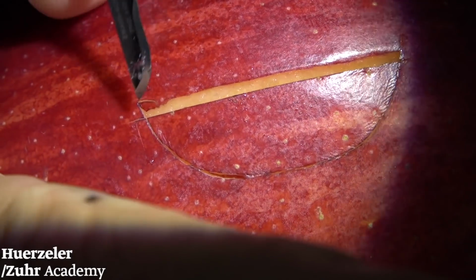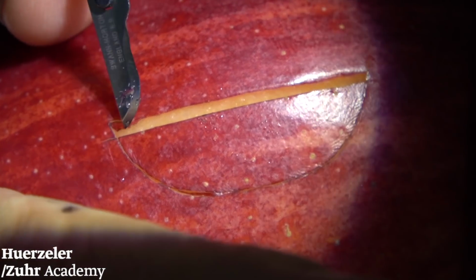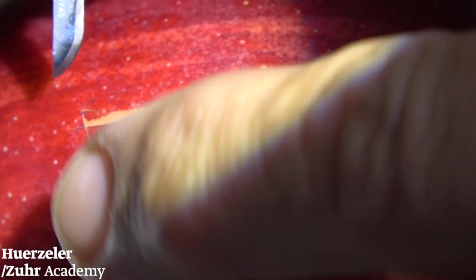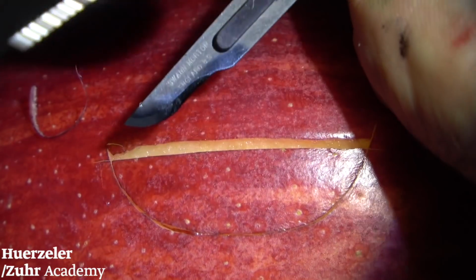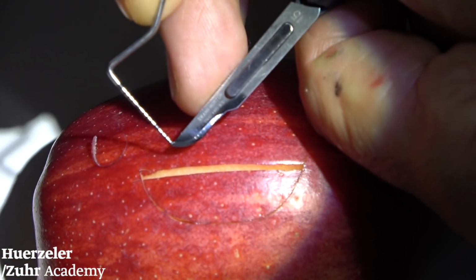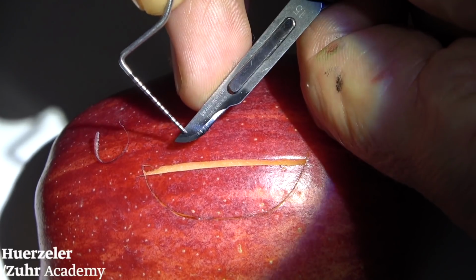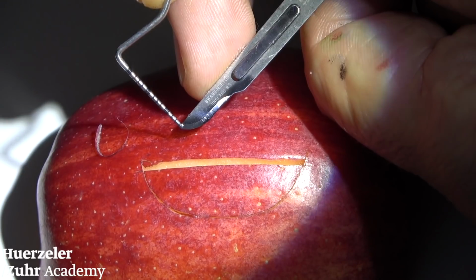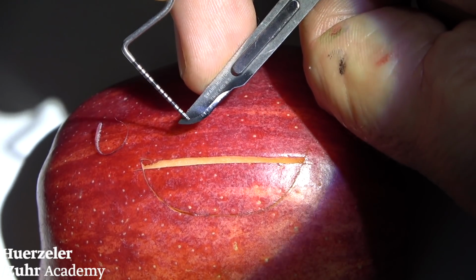And now comes the moment where I need to work in this direction. I have to work with the tip of the blade, and that's why I need a very big surface here. You remember? I said you need a blade which has a big surface here. You don't want a 15C here. This blade does not have a wide, bright surface here.